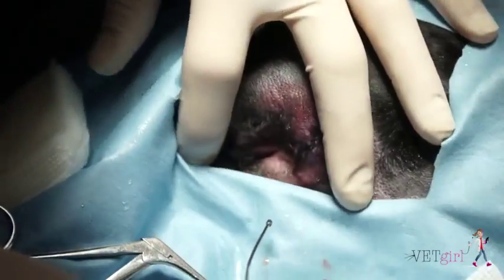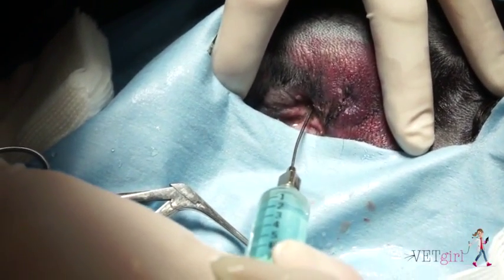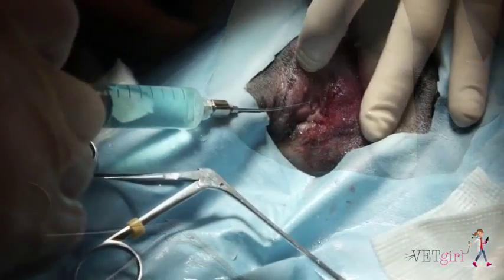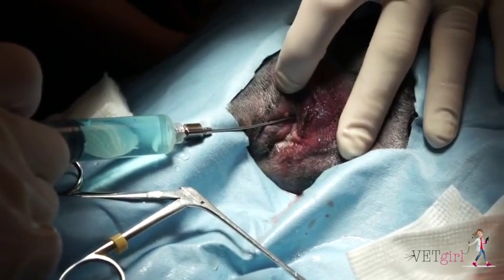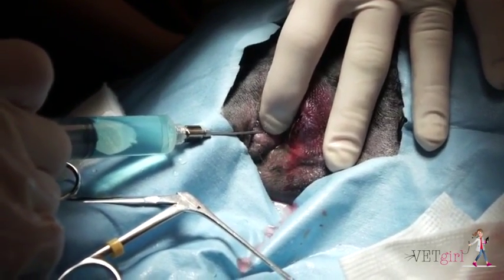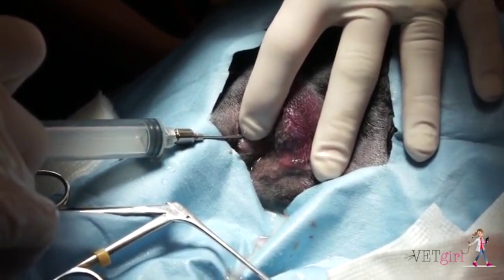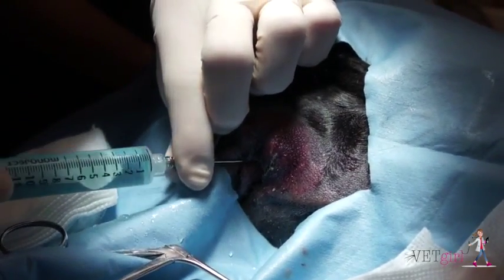We do this several times until the lavage fluid is clear. Next, using an olive tip curved syringe, or a 20-gauge polyethylene intravenous catheter, or whatever appropriately sized diameter you can find, attempt to cannulate the anal gland duct to further flush out the duct. You want to do this until the fluid is clear.